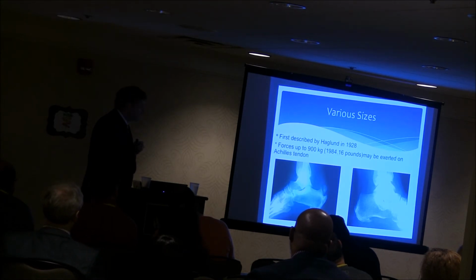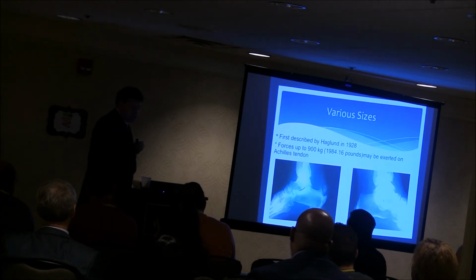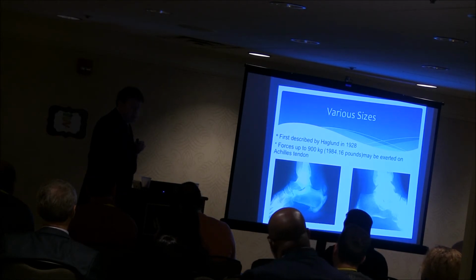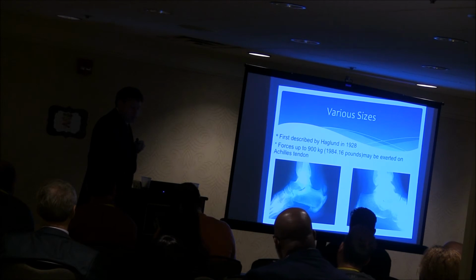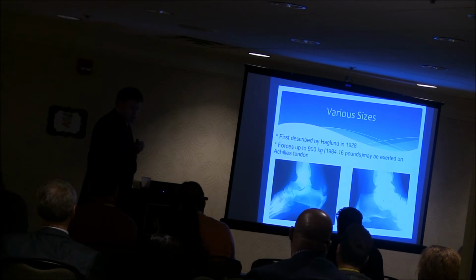patient is definitely not a candidate for an in-office Haglunds deformity. I think you'd be crazy to do that. In all honesty, if a person were to try to do a surgery on that patient, I think it'd be a disaster like the hospital that I saw in Texas, okay? But if you look at the one on the right, this is a very mild Haglunds deformity. If the patient is the right patient, if they're small, petite, this could be done in the office, okay?